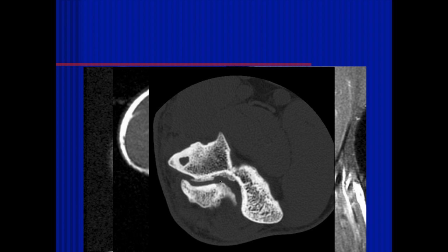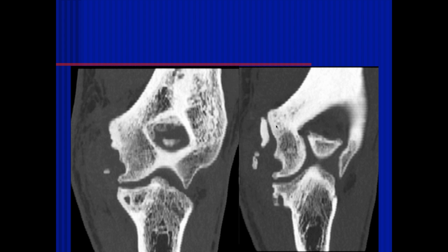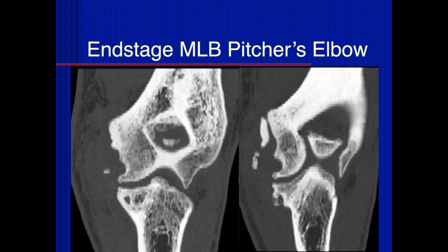So this is that same Major League Baseball player. Notice on the CT, we can see all these subchondral osteophytes posteriorly here. There's the tunnel for the Tommy John procedure. Here's tunnels both proximally and distally for the Tommy John procedure. And this was kind of an end-stage pitcher's elbow.